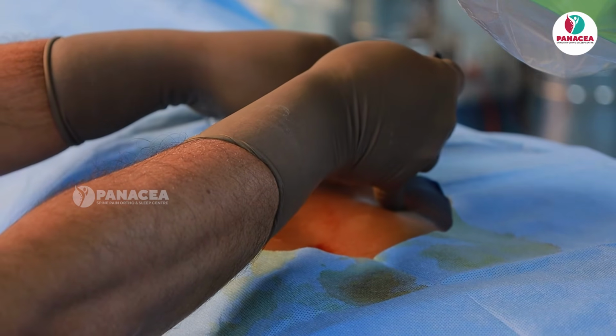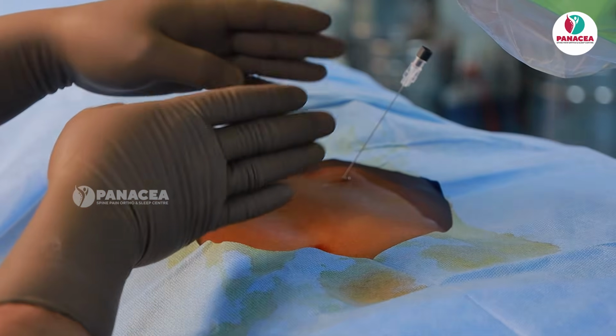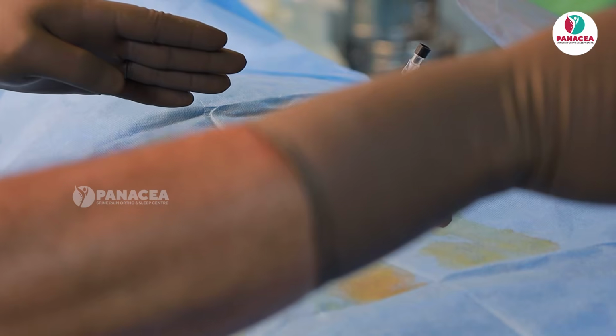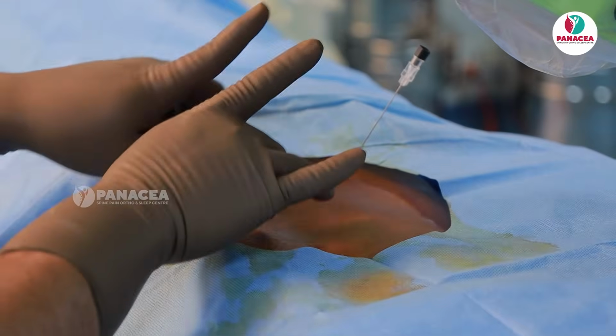So ergonomically I am opposite to the fluoroscopy, you see, so that I can watch the monitor to see what I am doing. And this is my eye, bone is my friend inside, and my eye is the fluoroscopic beam.